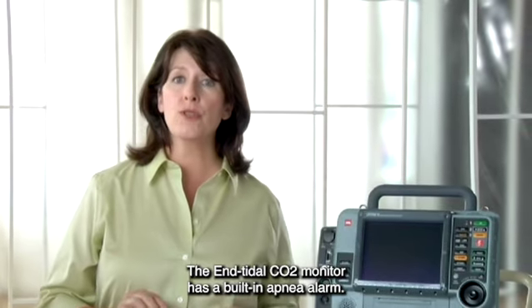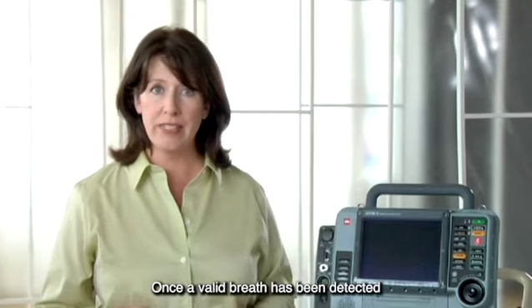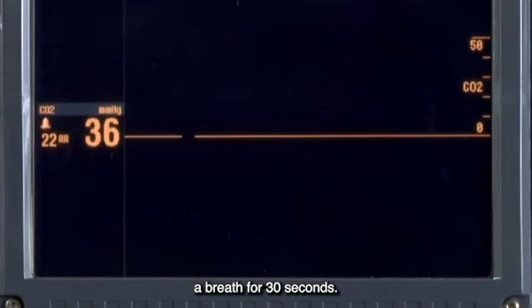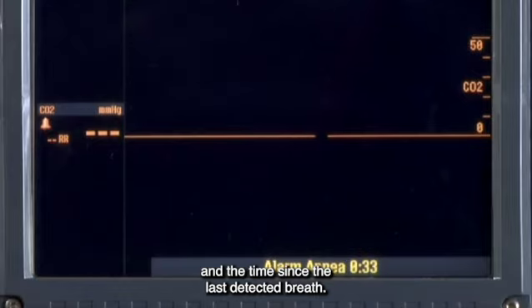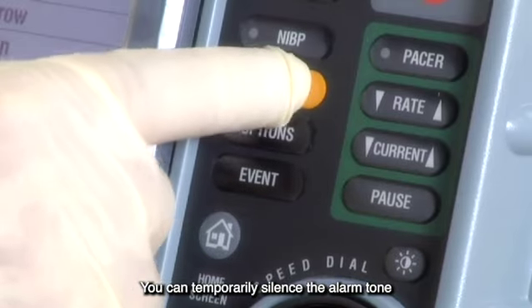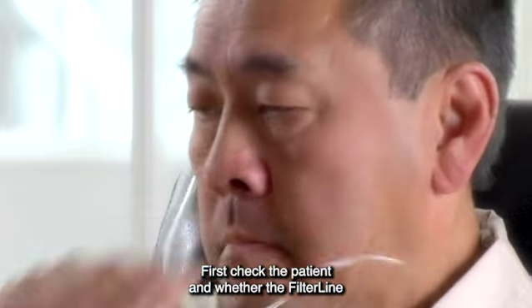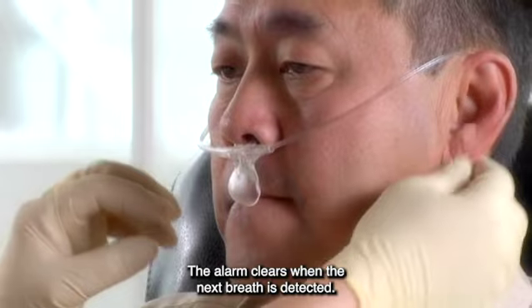The end-tidal CO2 monitor has a built-in apnea alarm. Once a valid breath has been detected, the apnea alarm triggers if the monitor hasn't detected a breath for 30 seconds. The message, "Alarm Apnea," appears, and the time since the last detected breath. You can temporarily silence the alarm tone by pressing Alarms. First, check the patient and whether the filter line is still attached. The alarm clears when the next breath is detected.